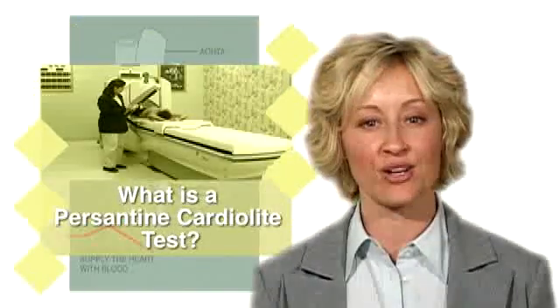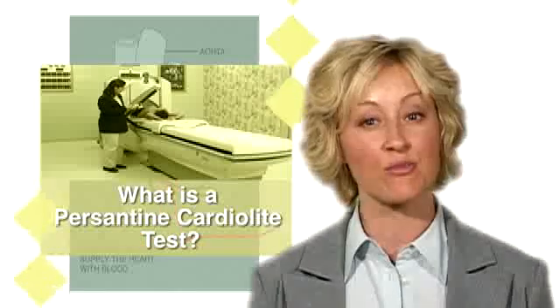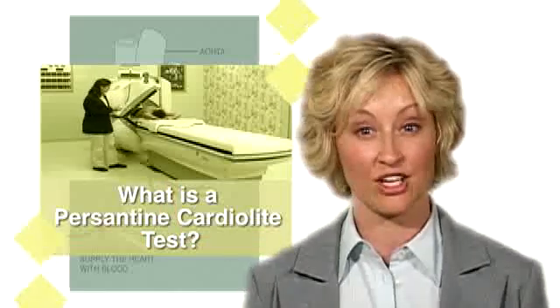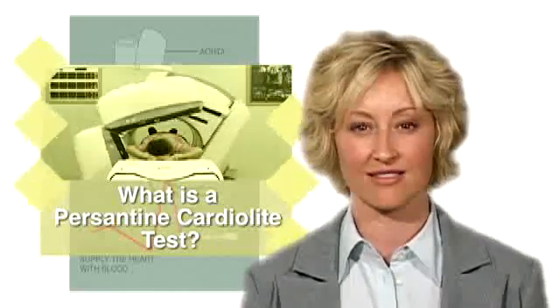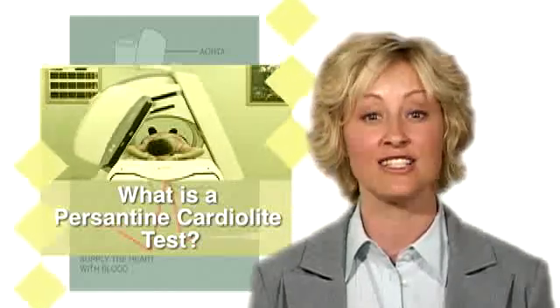The Persantine Cardiolite Test evaluates the adequacy of blood supply to your heart muscle. With coronary artery disease, the heart muscle may not receive sufficient blood when under stress. A Persantine Cardiolite Test is useful in detecting the presence of coronary artery disease.